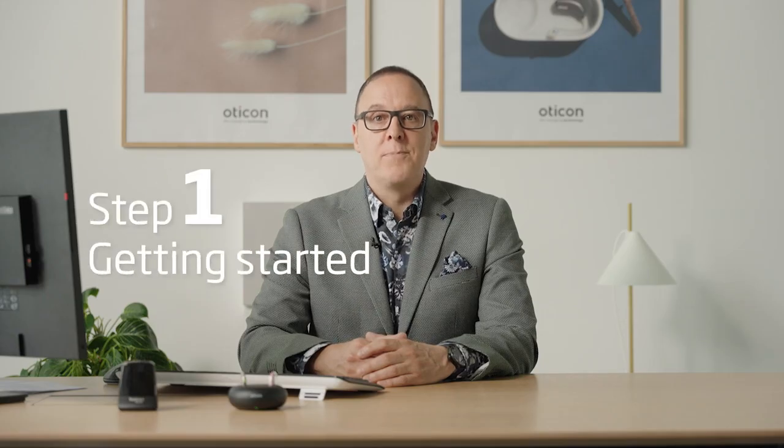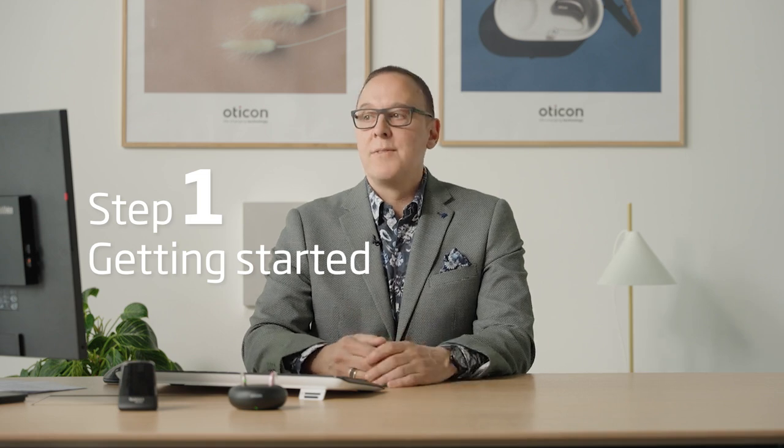My name is Dave Gordy. I'm the Director of Pediatric Audiology at Oticon headquarters. And today, in this brief video, I'm going to show you the 5 easy steps to fitting an Oticon Pediatric hearing aid. Step 1 is getting started.